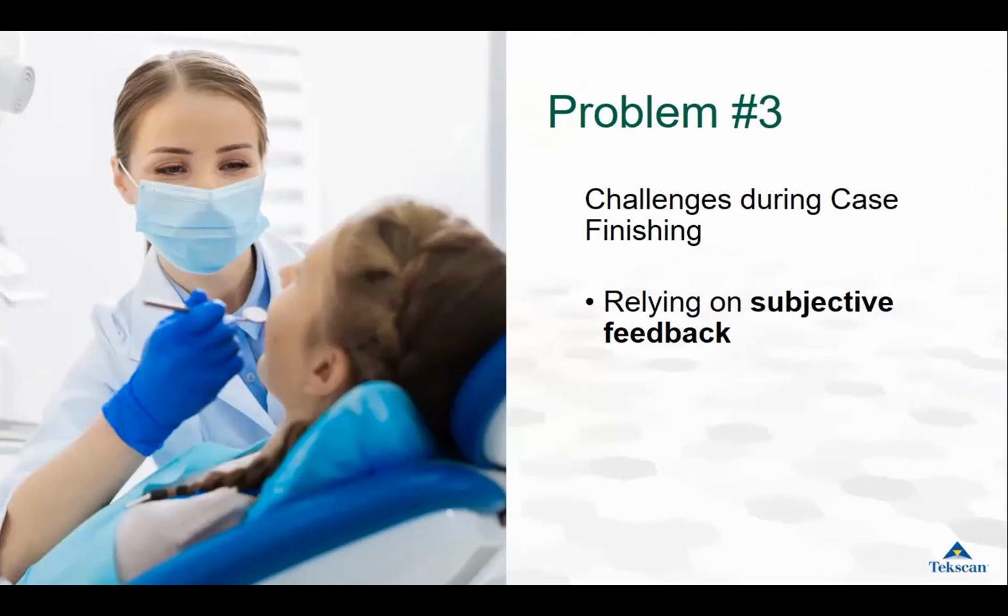The third problem that's been identified by our doctors is when they are finishing a case, whether it be a crown, a bridge, or a larger case, when they're ensuring that the bite is balanced and asking the patients, how does it feel? The patient sends you as the dentist on a journey of chasing the bite. Of course, you want to make sure that the patient is comfortable, but ultimately you need to make sure that the bite is balanced and that the right adjustments are done.